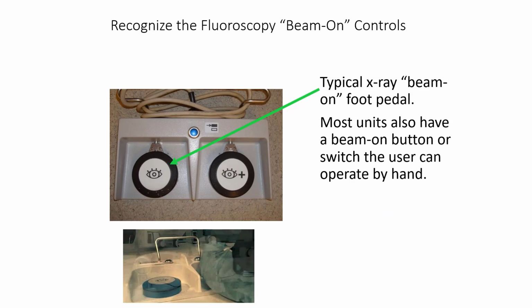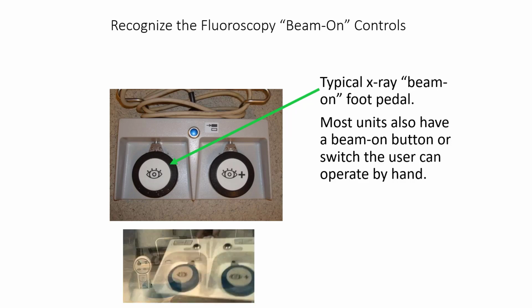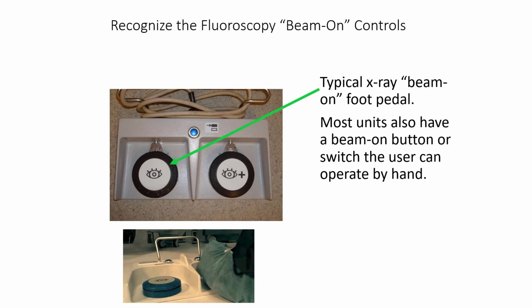One of the things that the radiographer can do in conjunction with the surgeon is to announce whenever the exposure starts, "beam on," in other words, the foot pedal has been energized, and "beam off," that the radiation is no longer being utilized. Why? Because surgeons are concentrating on what they're doing. They're forgetting about the actual foot pedal. A lot of times they might end up just leaving their foot on the pedal and creating a lot of exposure that doesn't need to be used. By being aware of the beam on and beam off time, they're able to control the amount of radiation better.